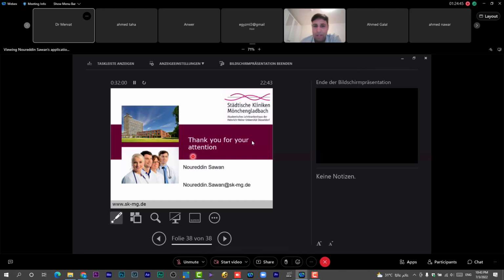Actually, I use Insight X myself. I don't use Carto because I'm more acquainted with Insight X. That's the system I use all the time. Carto, it's not all the time I use it, so most probably Insight X, even with the map shift and some changes. I try to be more accurate in doing the map itself. Like I do it once, twice, and a third time, and all the time I try to take the mean every time.